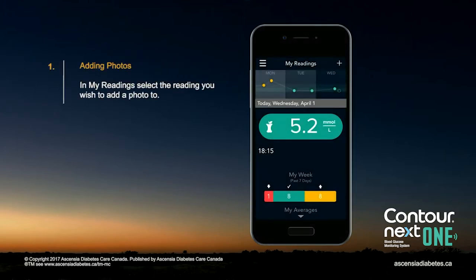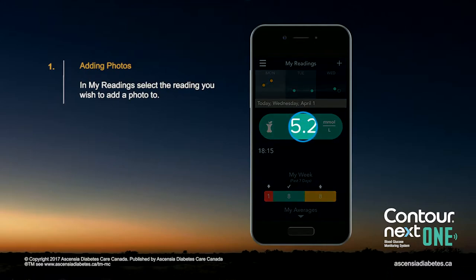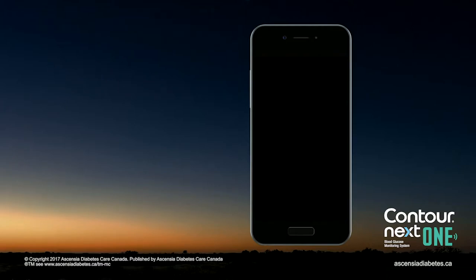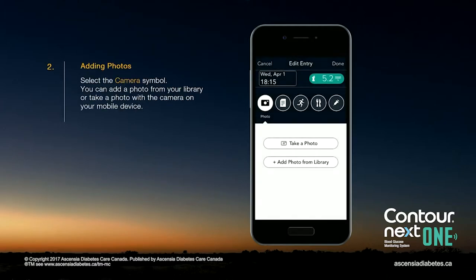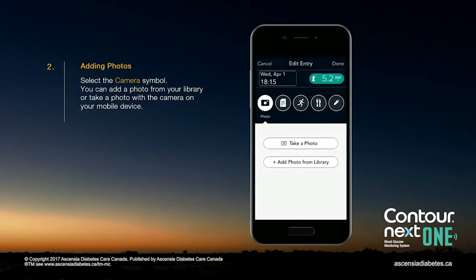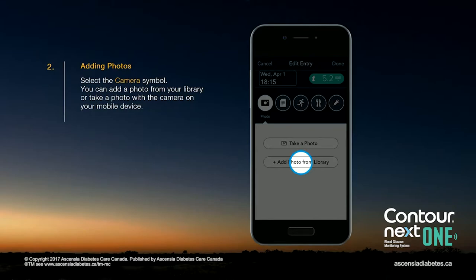In the My Reading screen, select the reading you wish to add a photo to. Select the camera symbol. You can add a photo from your library or take a photo with the camera on your mobile device.